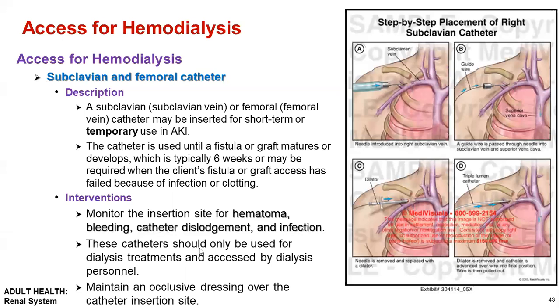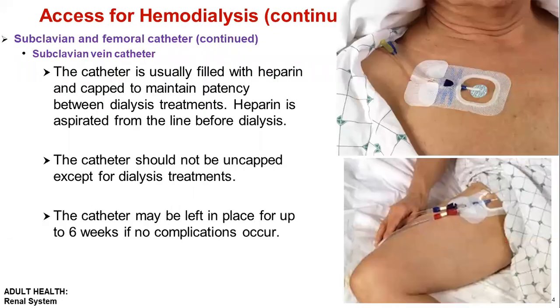This catheter should only be used for dialysis treatment and accessed by the dialysis personnel. So maintain an occlusive dressing every time and prevent it from getting wet. What else?